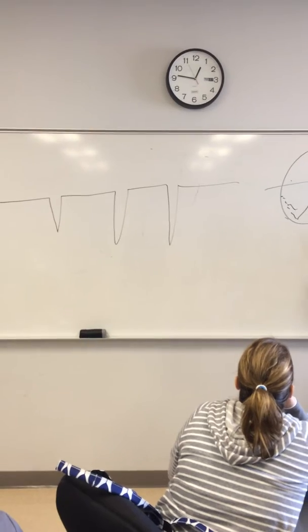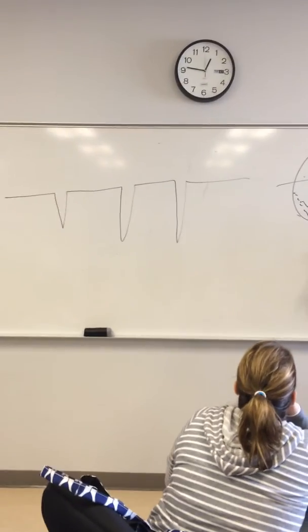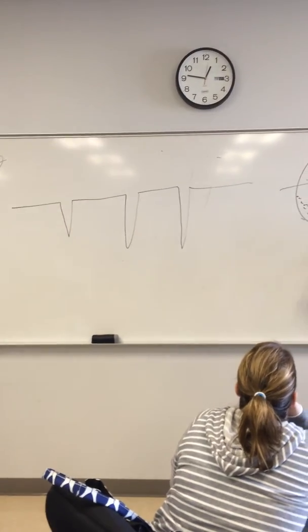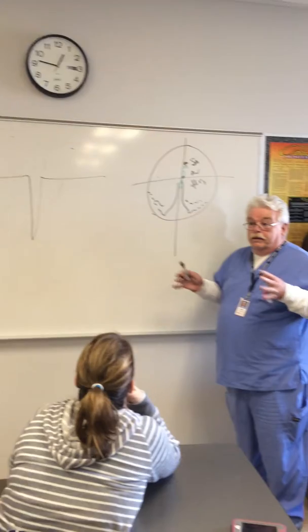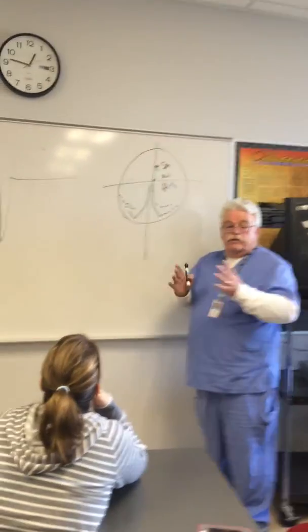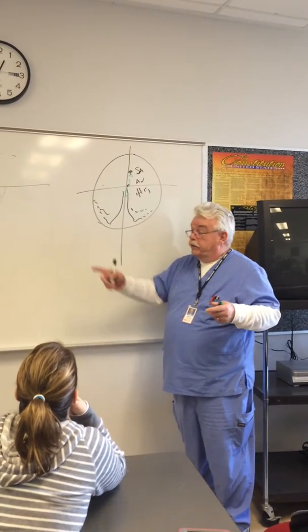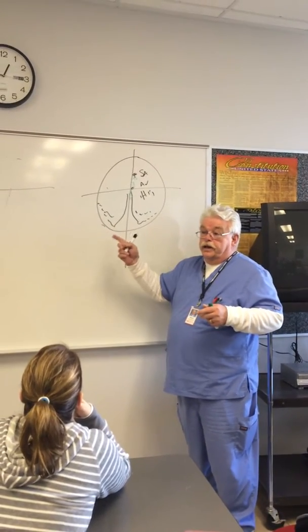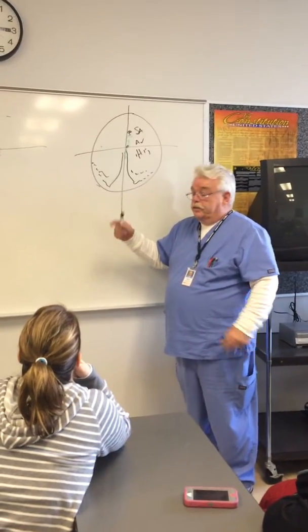The fourth question you ask yourself is, is the QRS happy? Is it upright? No. Does it have a T wave like it looked in normal sinus rhythm? You see why normal sinus rhythm is so important to understand? Because that's right, everything else is wrong. This is goofy. The QRSs are very wide. They're very bizarre looking. This is knocking on heaven's door. This is bad, bad, bad.